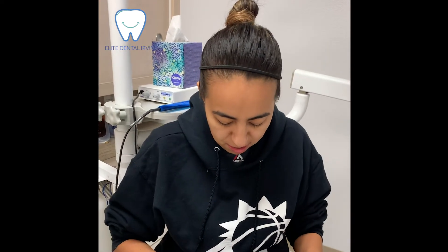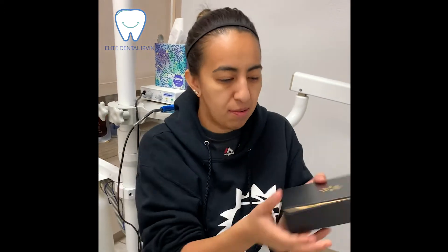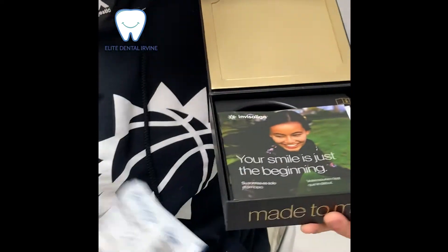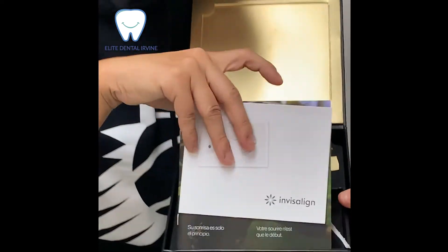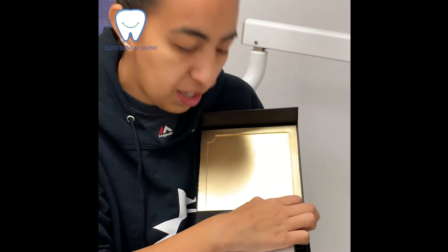So Invisalign also includes this box that you get. It's basically like a little care package — you can put your treatments in here. It comes with little booklets, an instruction guide, and also cleaning care instructions.